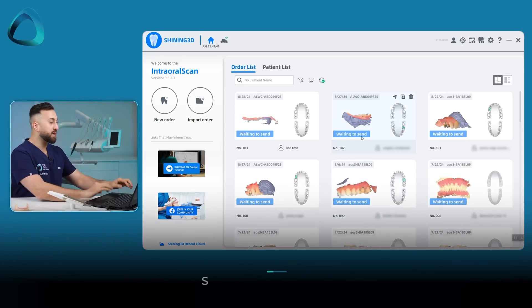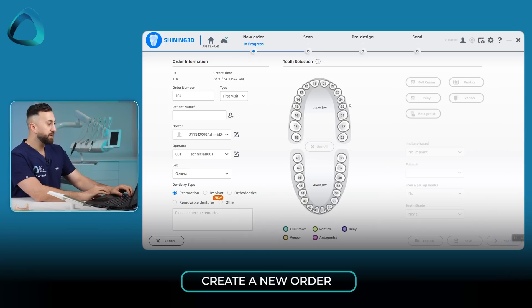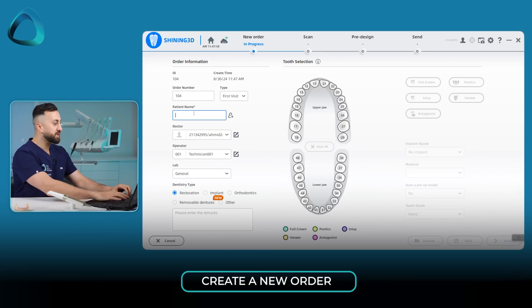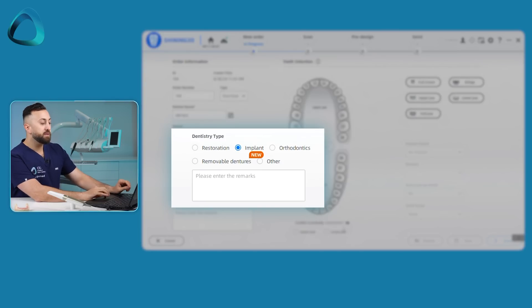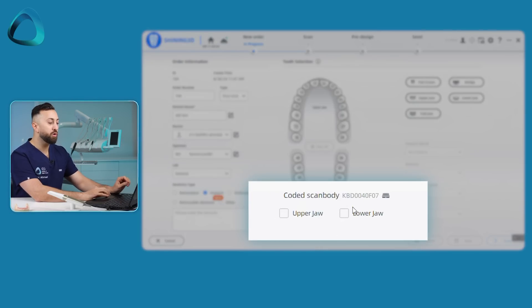So we're going to test the whole workflow out and see how it actually works. Over here I've got the Shining 3D software. You start up the software and create a new order — that's the first step. You put in the patient's name; I'll just put in IDD test. In the Shining 3D lab form, you need to click implant, and then you'll see at the bottom here: coded scan body.